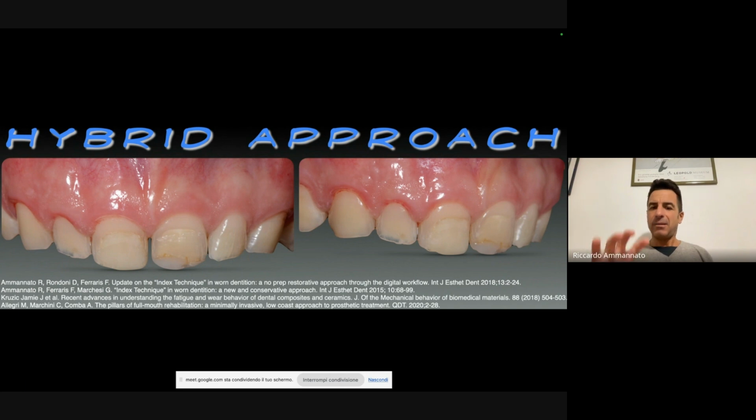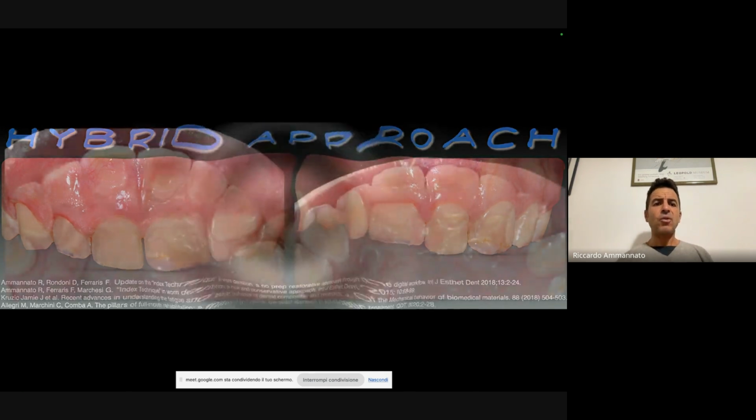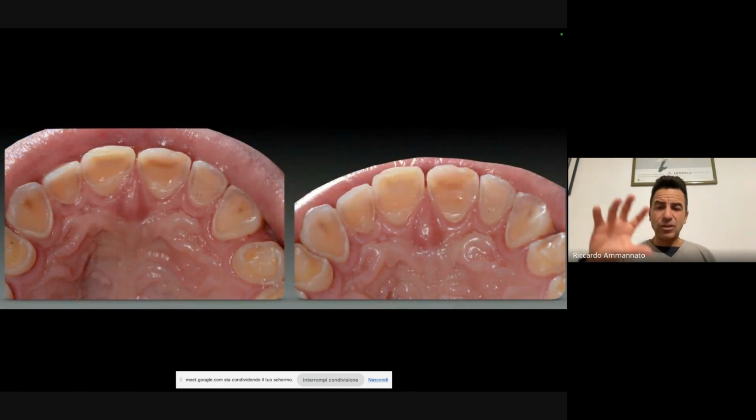Here we go to the second and last case I'm sharing with you. And again, the project is the same as you've seen before. So we have done the 4 table legs for the first molars and the canines, and the rest is a molding approach. Also here we had a mix of attrition and corrosion, and the patient was aware of all this. The two patients are quite young, around 39, 40 years old. And so I went, as I mentioned previously, full digital workflow.